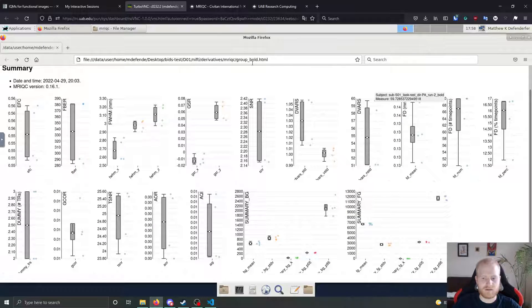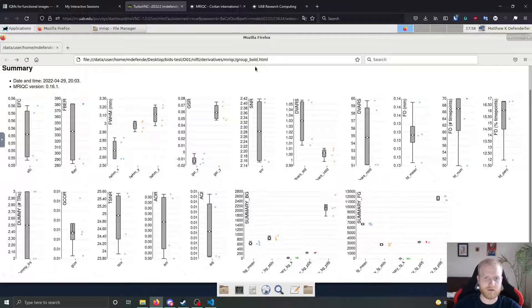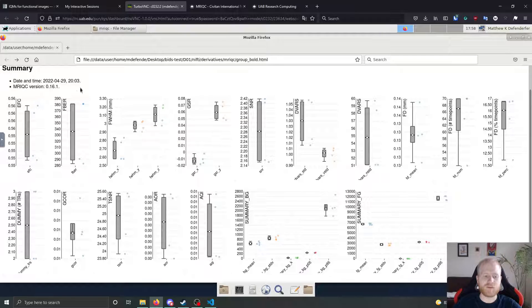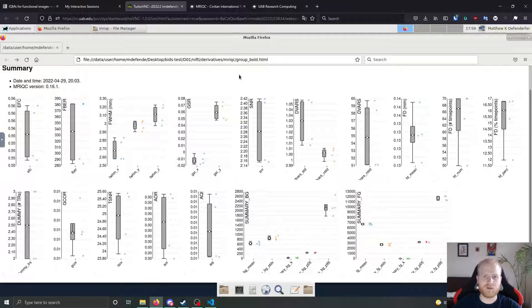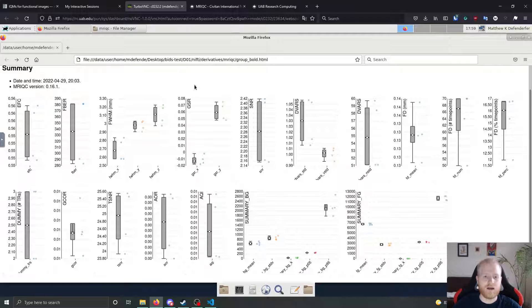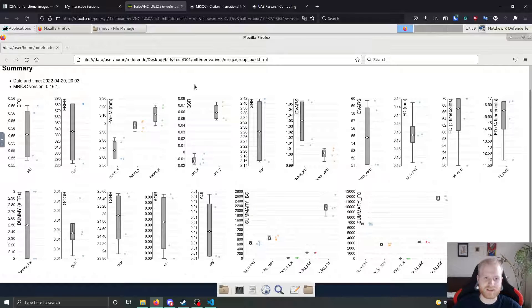So from there, what I would suggest you do is to run all of the participant level MRI QC first, and then also create the group level metrics at the same time. And then the group level plots can help you see which ones are extreme outliers first. So that you can quickly go and look at those and determine whether you need to recollect that data as soon as possible or whatever. And then from there, after you deal with any outliers that you find, you should go through each of the individual HTML files and rate them and have that as information for later on down the line, if you're publishing the data or sharing it with anybody else or just sharing it within the lab.